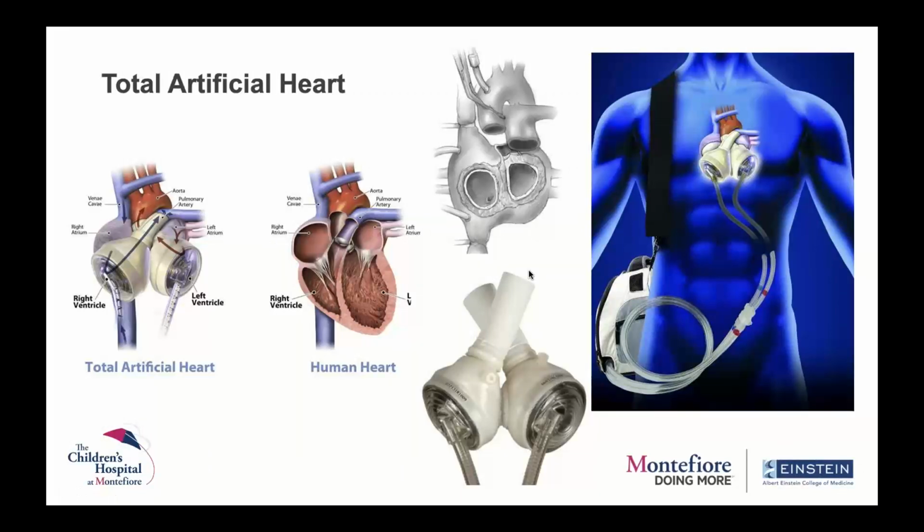The last device that I just want to quickly mention is the total artificial heart. It is not a very commonly used device. It is in patients who have both sides of the heart, the right and the left, have failed, and you now need support for both sides. It is a pump, and again, a pneumatic pump that you can connect to the heart.